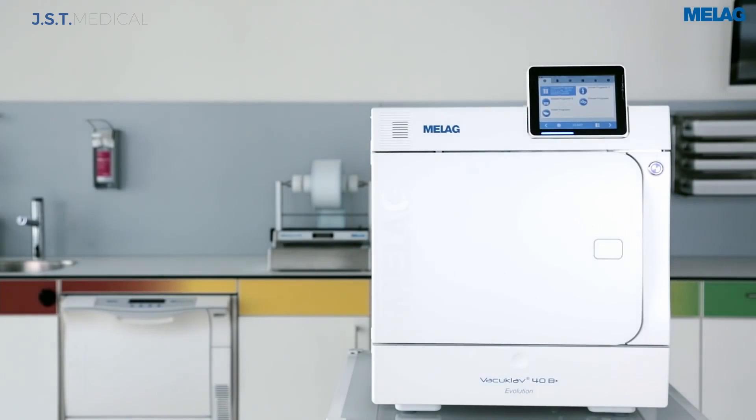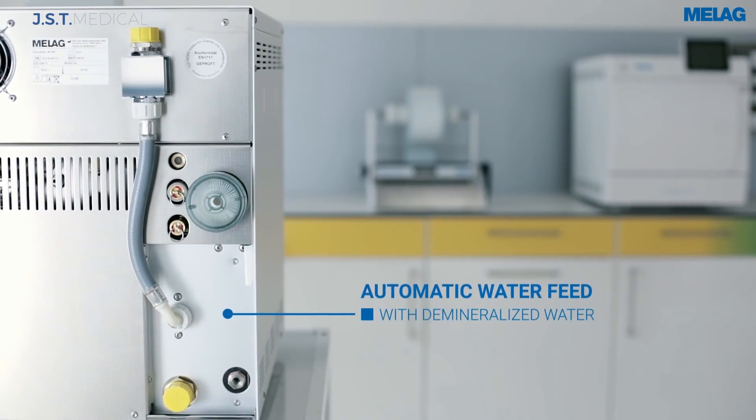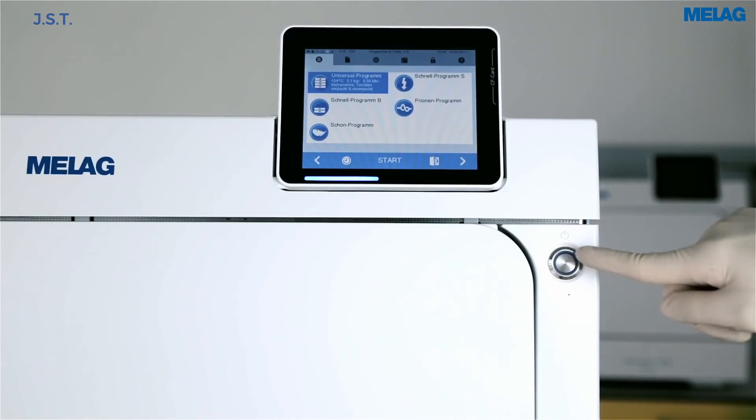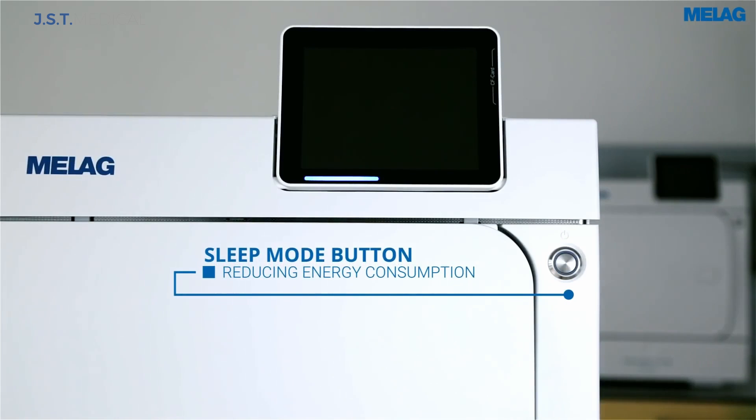These plumbed-in units require a drain, mains water, and a water treatment system or an external feed water bottle. The energy-saving standby button enables the unit to go from sleep to full operation instantly.